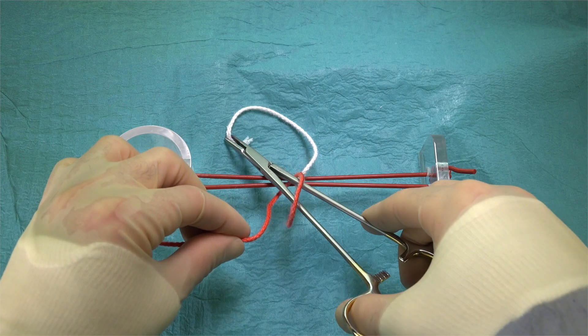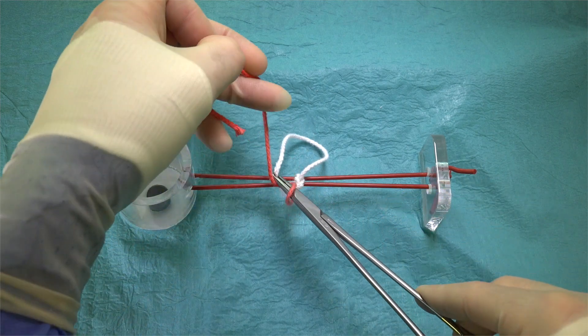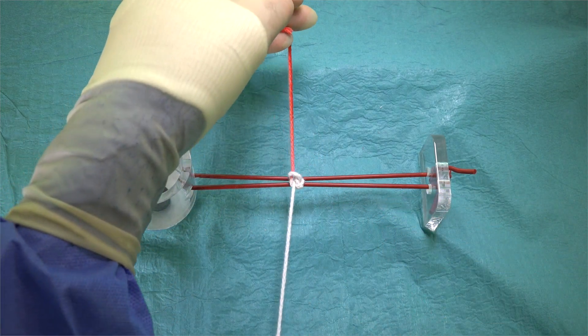To further secure the surgeon's knot, we then perform another single throw, ending with our left hand lying away from us.